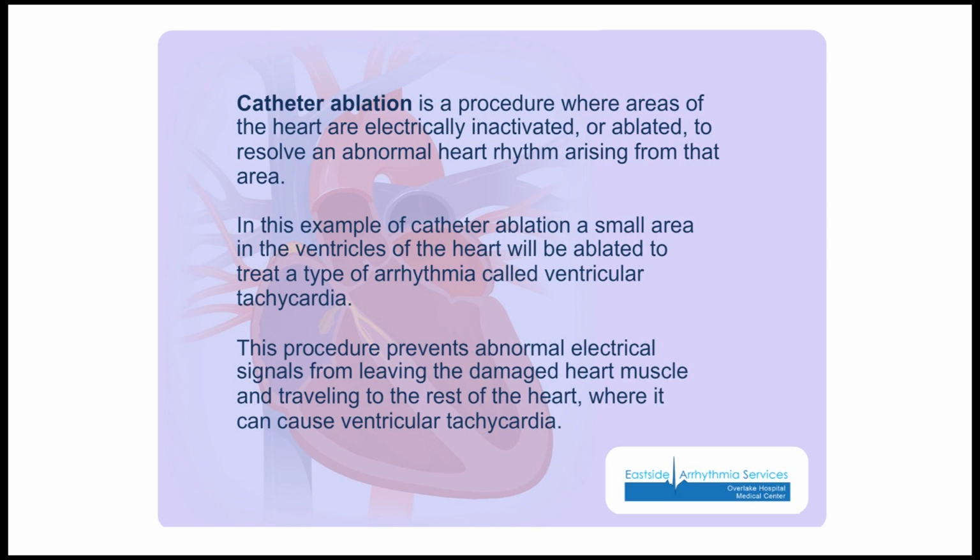This procedure prevents abnormal electrical signals from leaving the damaged heart muscle and traveling to the rest of the heart, where it can cause ventricular tachycardia.